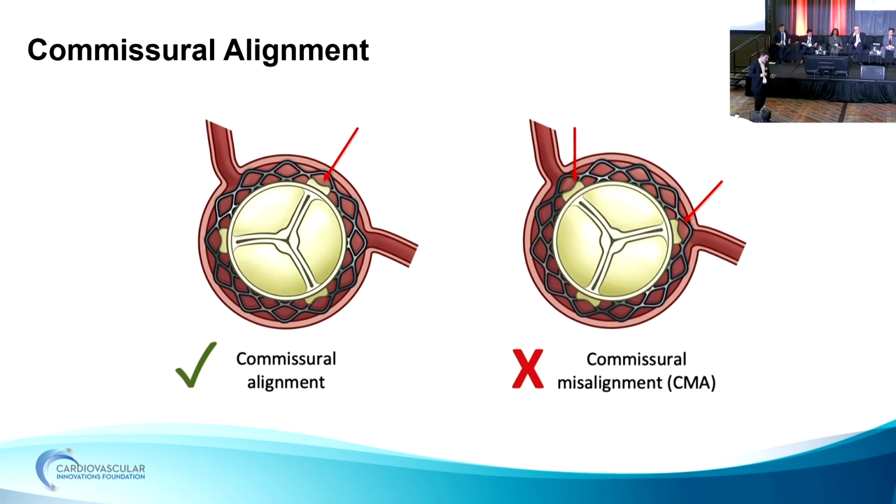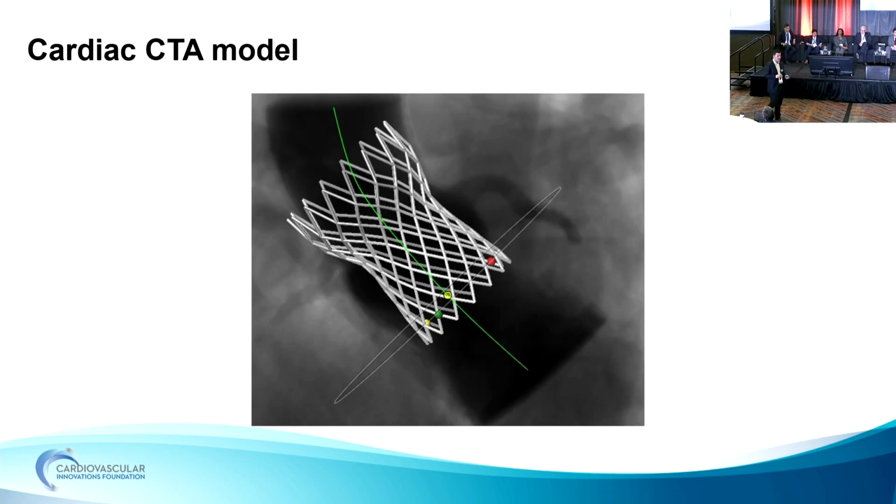A lot of the valves these days have actually changed their practice, and in their new iterations we've become better, become smarter, and we start giving more attention to that. So that's for people who don't do TAVRs, that's what we're dealing with. It's a CT model, it's not the reality, but that's what we're dealing with. You have a valve which sits a few millimeters below the annulus. You have your sinuses, and you have your left main, which should be open.